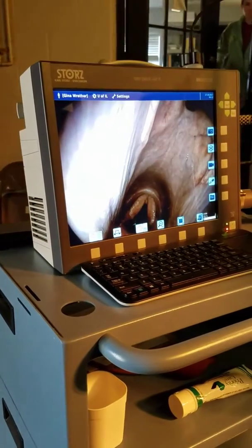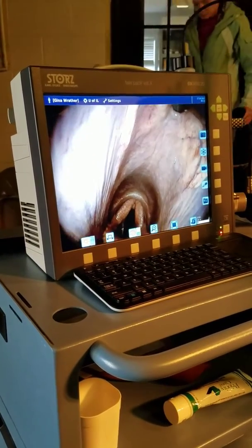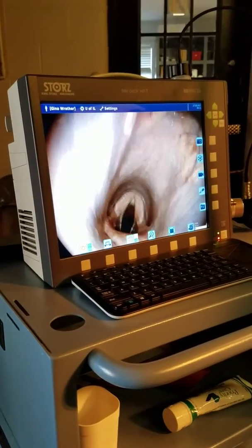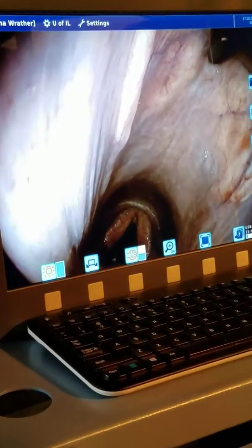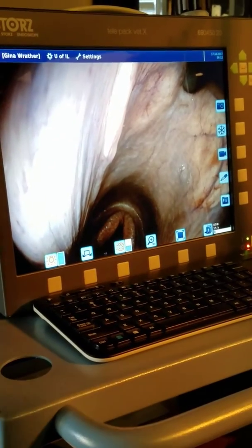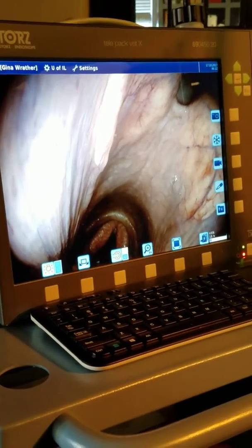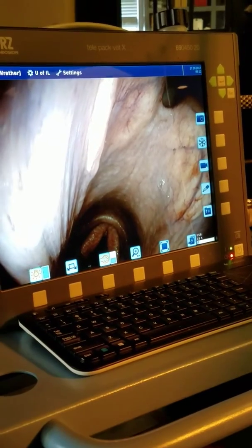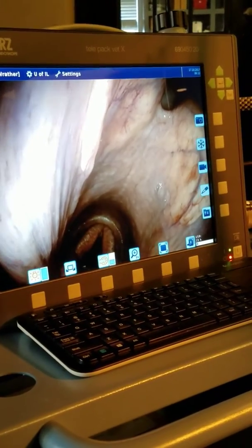Left and right, those are the openings to his guttural pouches. The strangles bacteria likes to live in a lymph node that opens up into the guttural pouch. What often happens is it abscesses inside those pouches, then ruptures, and then comes out those little slits — and that's why you get that snotty nose.